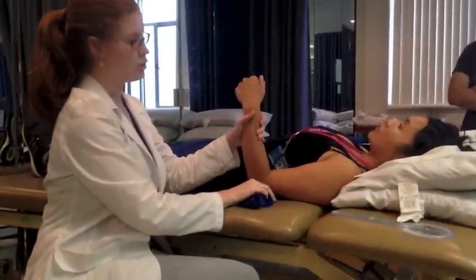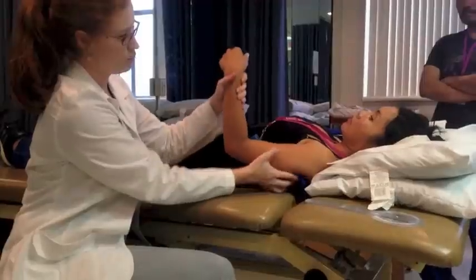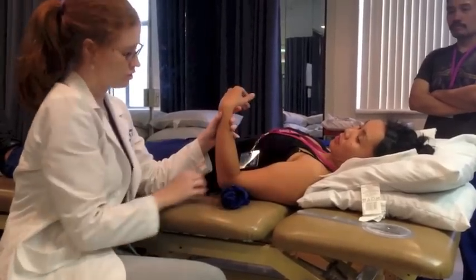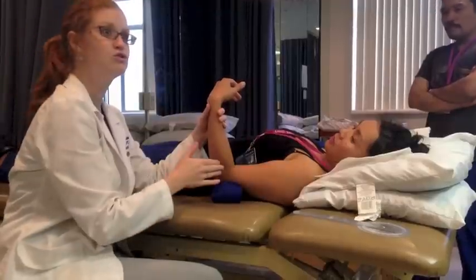I'm going to put this on the distal part of the humerus. Because if I put it like this, well then we're just raising the whole arm up. We just want to make the elbow higher relative to the shoulder. I'm going to fold that out — see how that's neutral?